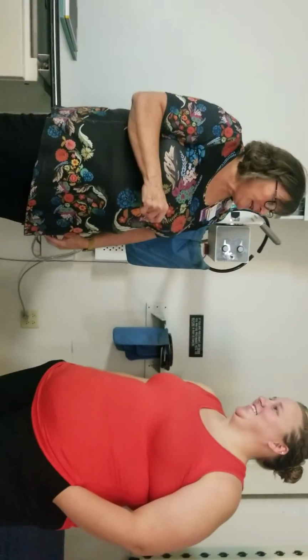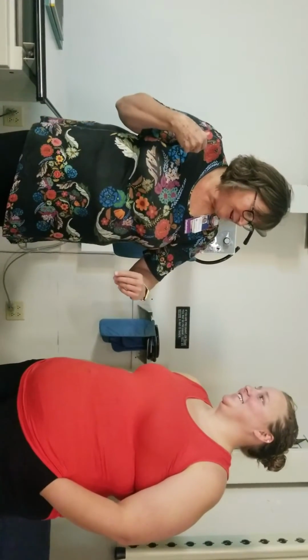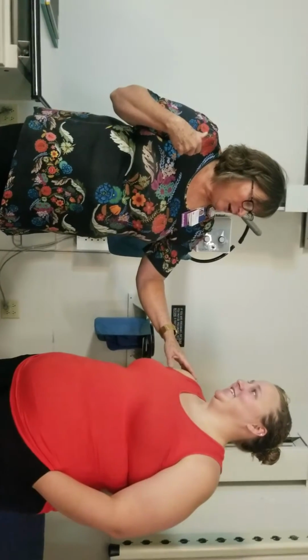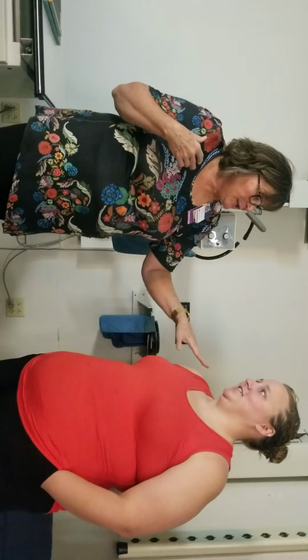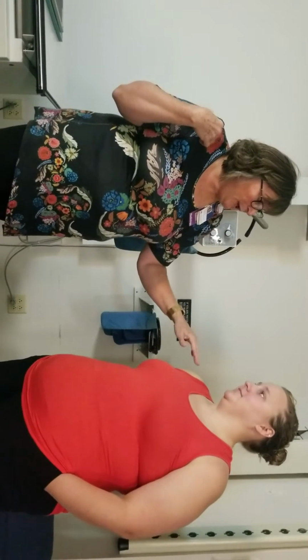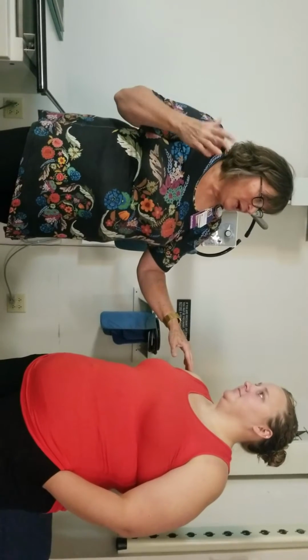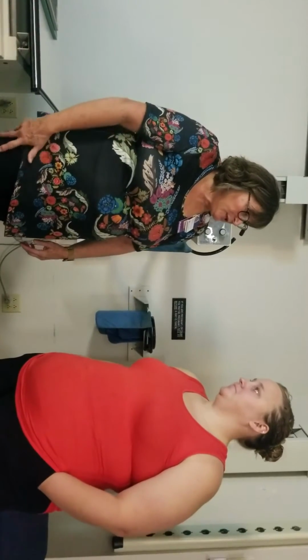All right, so we're going to be taking several pictures of your right shoulder. And we're going to take 2 pictures of your scapula, 2 of your clavicle, and we're going to take some special views of your AC joint. So we're going to compare both of them. So we'll have 2 of them. So a total of at least a minimum of 6 images. It should take us about 15 to 20 minutes. Do you have any questions before we start?